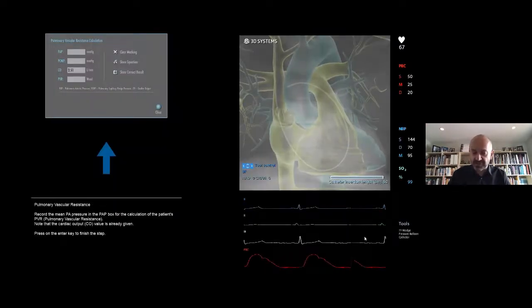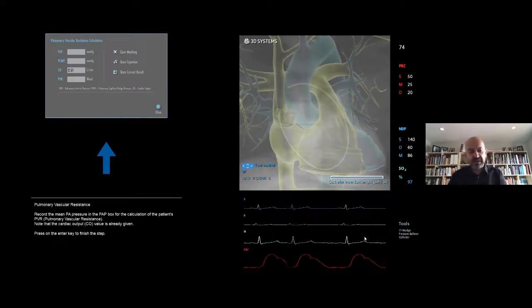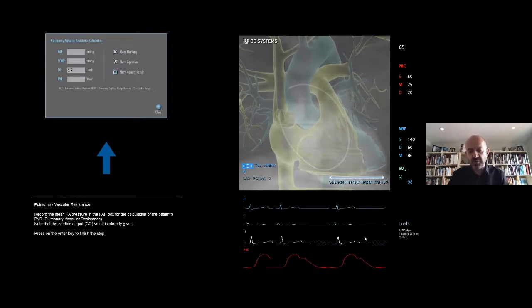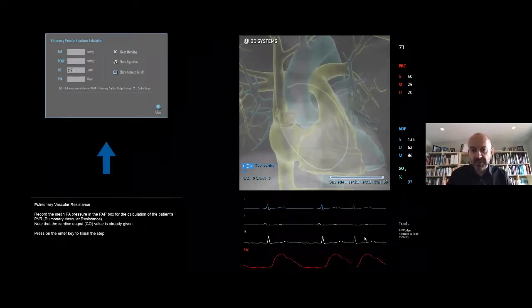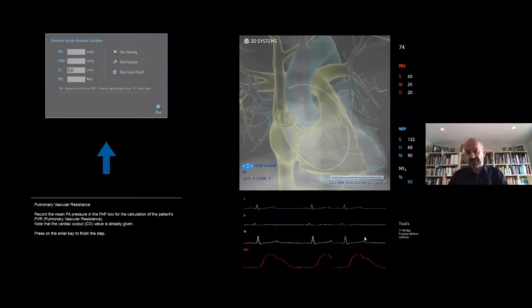There have been some Takotsubo reports in patients. Some have actually needed ventricular support. So this is where you would, from the cardiology perspective, use a PA catheter clinically to determine your cardiac output and your filling pressures to support these patients, especially if they need pressors.